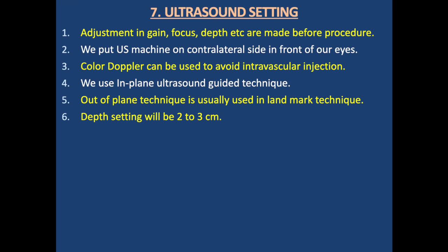For ultrasound settings: adjustment of gain, focus, and depth are made before the procedure. The ultrasound machine is positioned on the contralateral side in front of the operator's eyes. Color Doppler can be used to avoid intravascular injection. An in-plane ultrasound-guided technique is used; out-of-plane technique is usually used in the landmark approach. Depth setting will be a minimum of 2–3 cm.